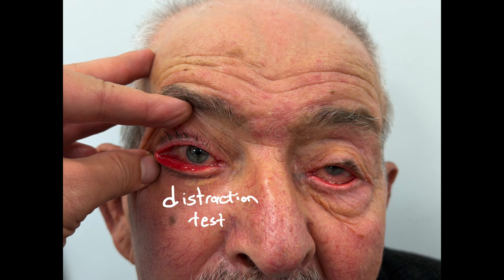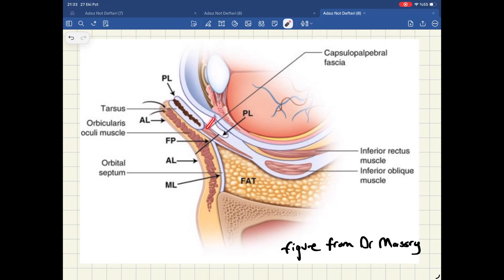As you can see, the distraction test suggested the Bick's procedure alone wouldn't be sufficient, so I decided to add a retractor reinsertion to my surgical plan. The goal of this surgery is to shorten the retractors by cutting them just below the tarsus and reattaching them to the lower border of the tarsus, allowing the eyelid to rotate inward with greater strength.